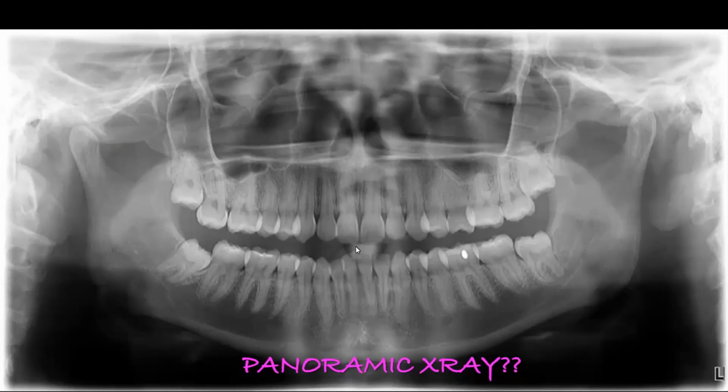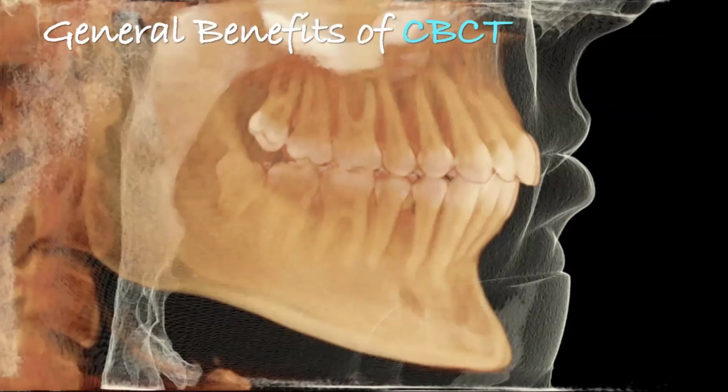And so it's one of those things where there's a lot of guesswork still involved in a two-dimensional image like a panoramic X-ray. And on top of that, I think of it as a glorified tooth counter. Honestly, I don't really get a lot out of the panoramic X-ray. I really don't use them much. And so the difference with that and the CBCT, there's lots of benefits that are just general of a cone beam CT scan machine and just owning one. First thing is, this is a super pan.